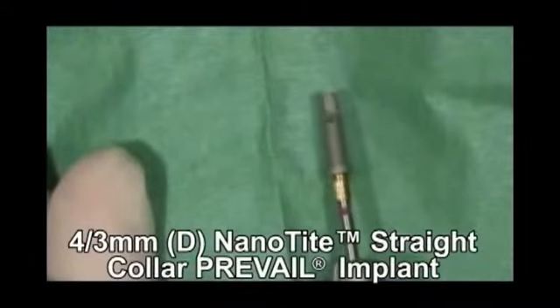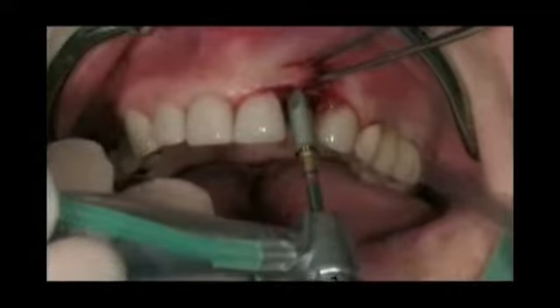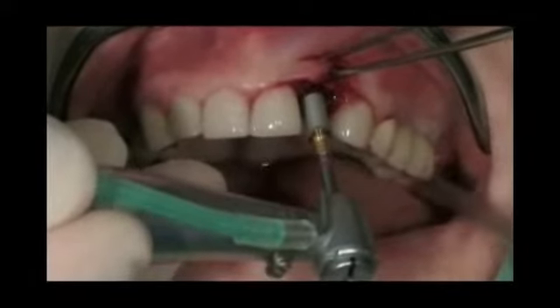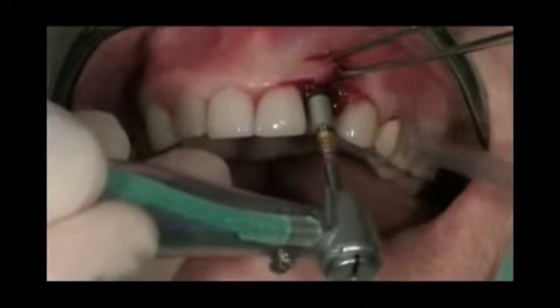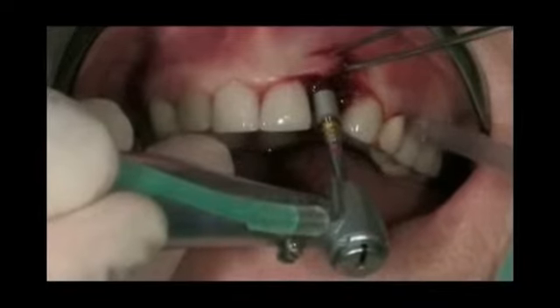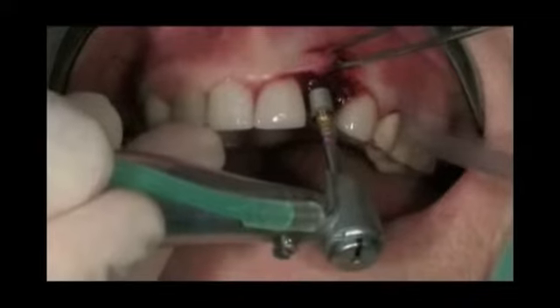The implant package was opened. Using the Certain implant driver tip, the sterile implant was picked up by engaging the internal interface hex configuration of the implant. The implant was carefully carried to the mouth and placed into the prepared osteotomy at 15 to 20 RPM. No irrigation was used during the initial placement of the implant, per the recommended protocol for placement of a NanoTite implant. The insertion torque of the implant reached 45 Newton-centimeters, the torque limit preset on the drilling unit.